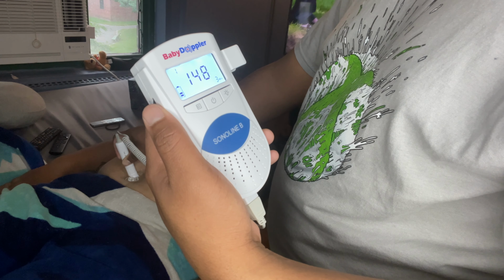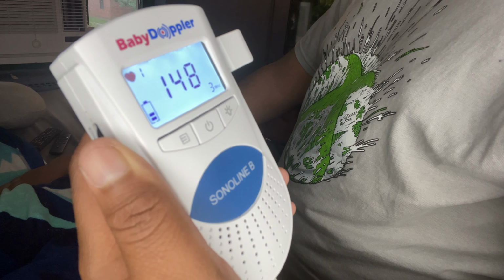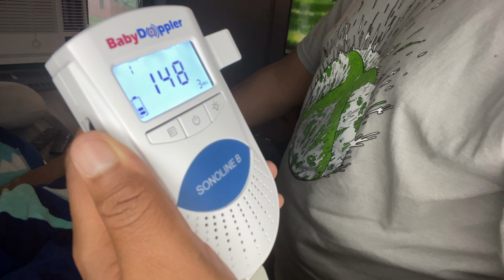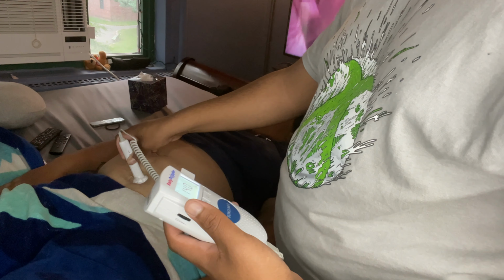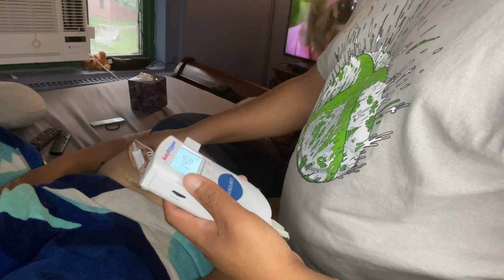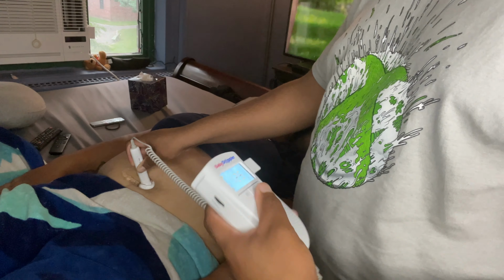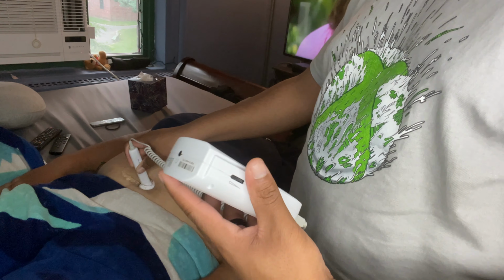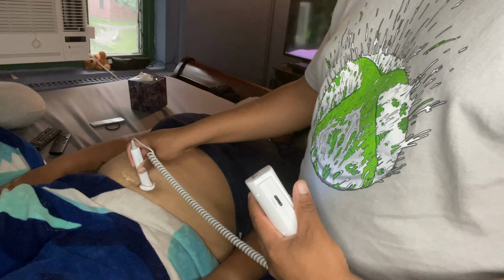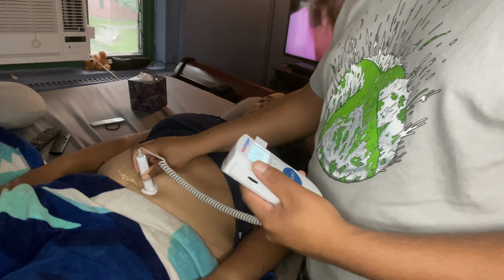Sounds like horses. It sounds like a horse galloping. And the number should be around, depending on how far along your significant other is, 140, 150 to 170, 180, all depends. But definitely ask your doctor. So you could keep a lookout of that.